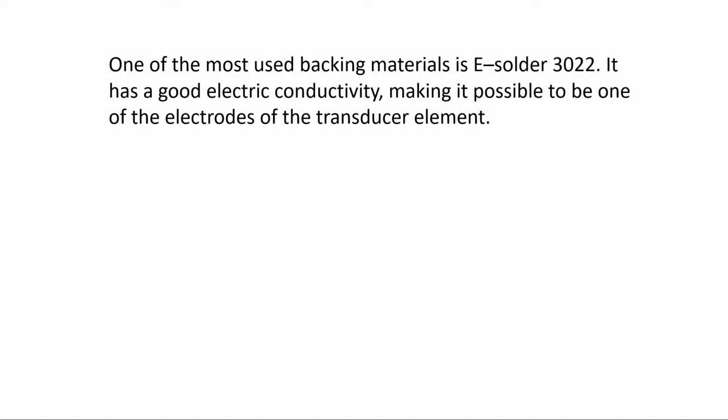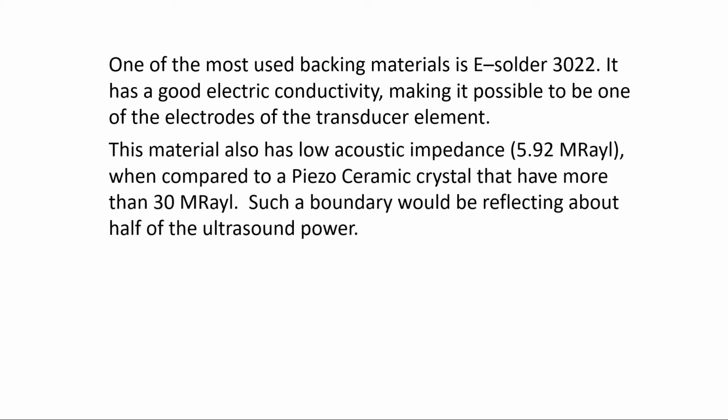One of the most used backing materials is the E-Solder 3022. It has a good electric conductivity, making it possible to be one of the electrodes of the transducer element. This material also has low acoustic impedance, 5.92 megarayls, when compared to a piezoceramic crystal that has more than 30 megarayls.